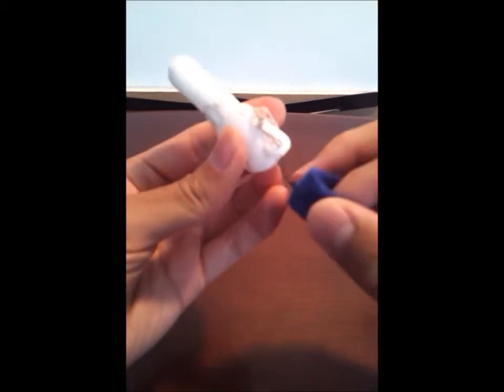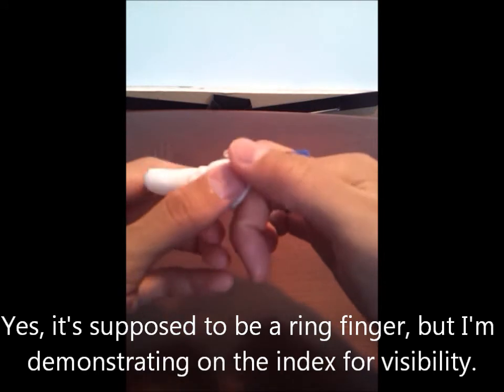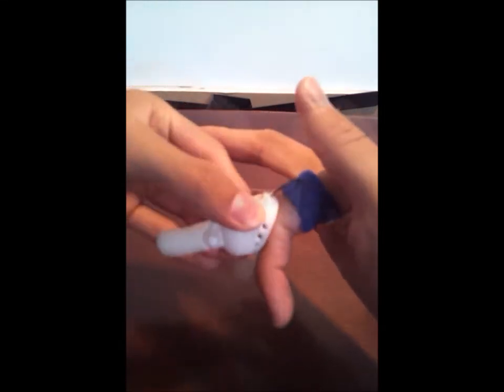Extension is actuated by another cord attached to a rubber band. Once the finger is in place, the flexion cord is pulled every time the middle joint bends.